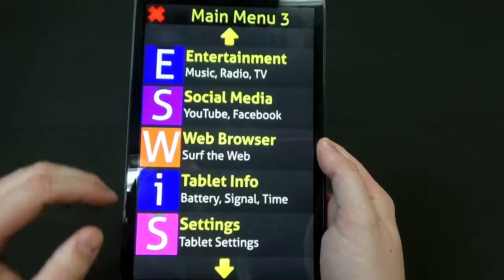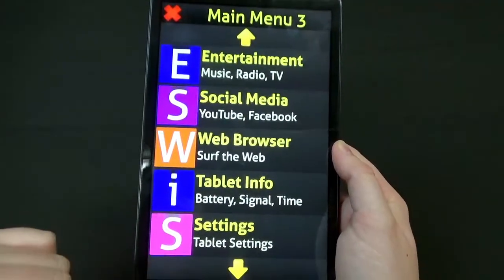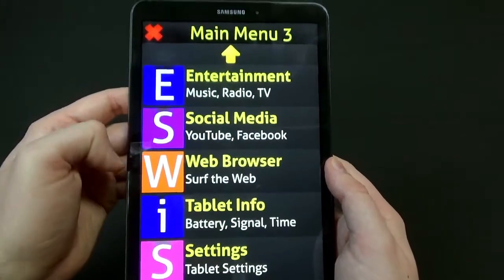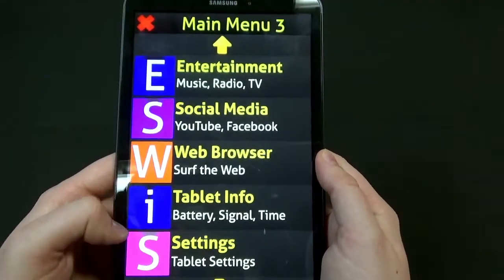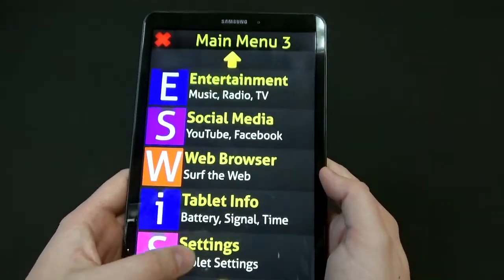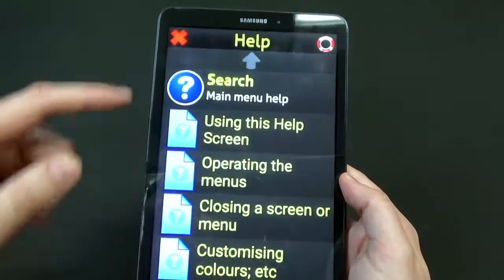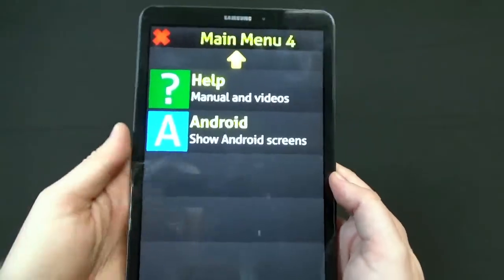For navigation, you simply press the up arrow to go up to the next part of the menu, or press the down arrow to continue down, and hit the red X to go back — it's really simple. You also have entertainment options like music, radio and TV, social media, YouTube and Facebook, a web browser, tablet info for battery life and signal, date and time settings, tablet settings to customize the user interface, and a help section with your user manual and videos. You can also exit to Android if you want.